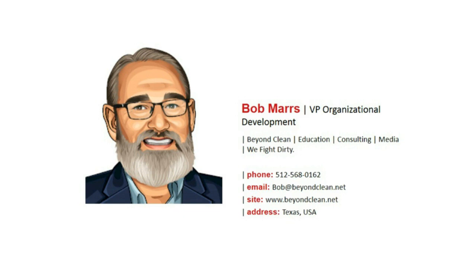Ethylene oxide has an OSHA short-term exposure excursion limit of 5 ppm. Hydrogen peroxide does not have an OSHA PEL, but a couple of states, Hawaii and Washington, have short-term exposure limits of 3 ppm. So from an occupational exposure limit, they're fairly similar. There's also the IDLH, the immediately dangerous to life and health limits, which for ethylene oxide is 800 ppm, and for hydrogen peroxide is 75 ppm.